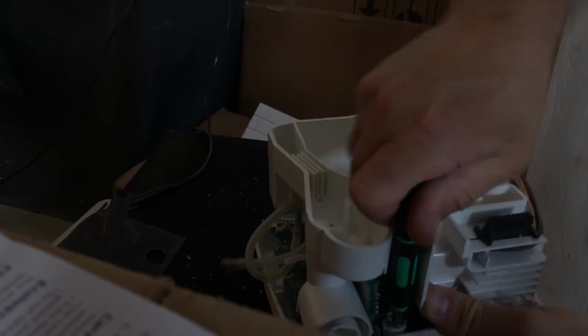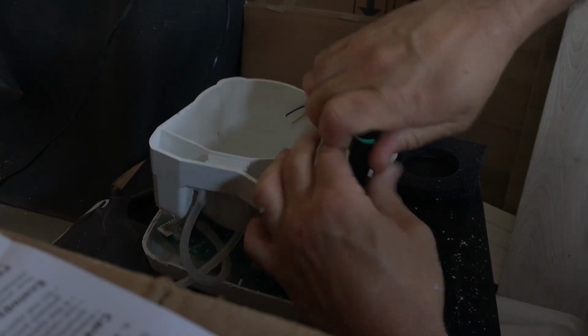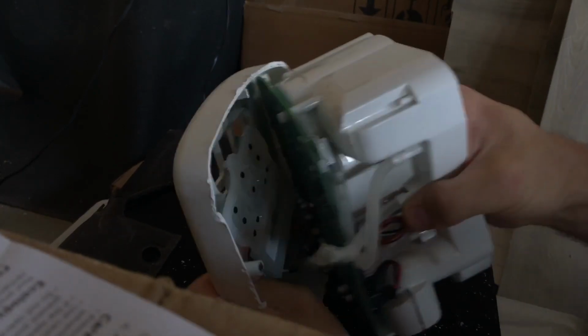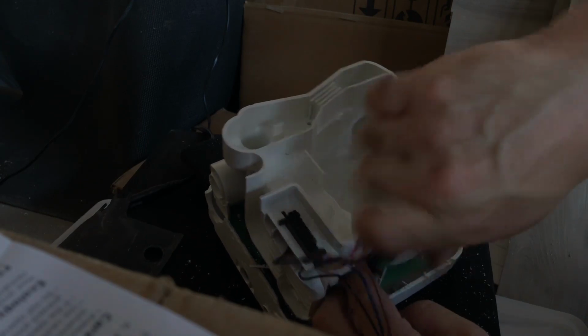And is there another one here somewhere? Yeah, that might be holding up the board here. Let's try that one as well. Okay, getting there. All right, that released it. See, these guys here. All right, any more holding this in? Gee, I still can't remove it. Why? What is holding it? One more there. Okay, hold on. Yeah, this is impossible to open without the right tools.